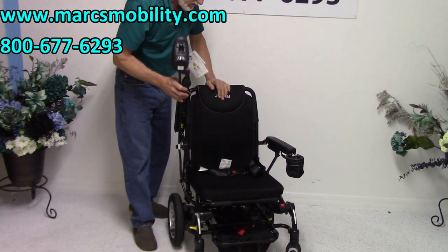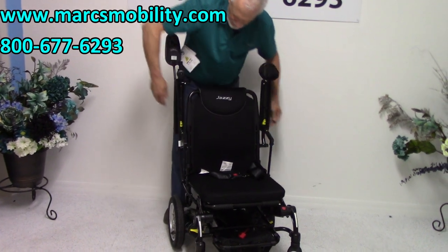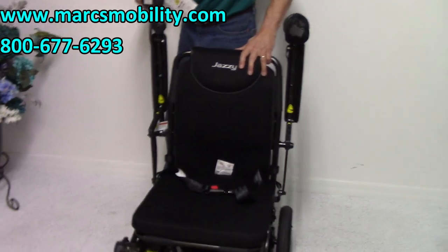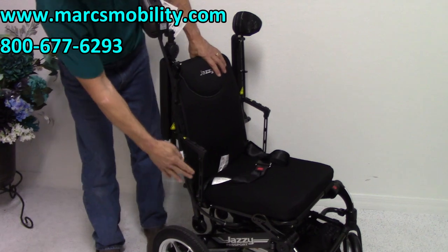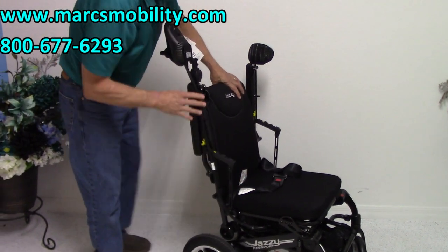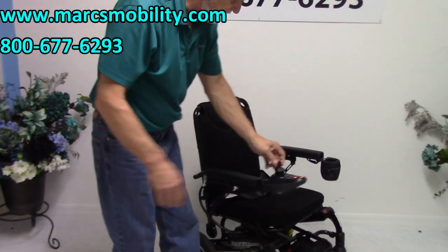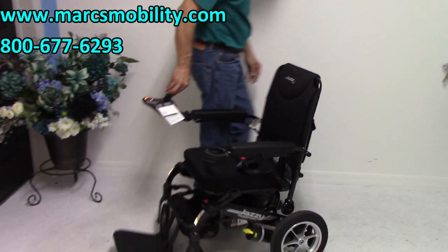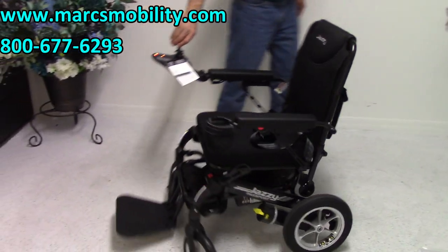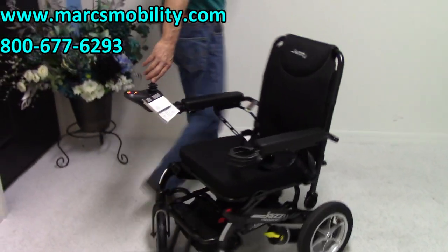The arms on this chair do flip up. When they flip up, this is what you have left, so if you're going to slide in from the side, the remaining arm structure might be slightly in the way. You can also see the turning radius on the chair. This is a rear-wheel drive chair, so it turns around the rear, which means it takes a little bigger turn.